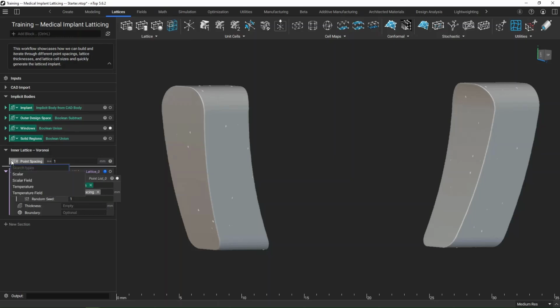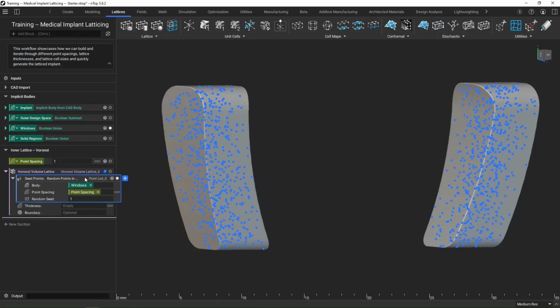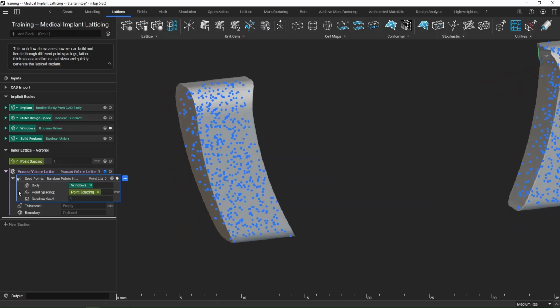I'm actually going to click on this number right here and turn this into a scalar field. Maybe you haven't really gotten into scalar fields just yet, but really I'm doing that so that I know that I can, in the future, variably change this point spacing. So right now we've got the constant 1 millimeter point spacing, but because I see this field icon here, I know that maybe I could use a ramp in the future and drive it. So we've got some sort of variable change there. We'll keep it nice and simple for now with just that 1 millimeter. But by creating that type, then we have the flexibility in the future to use it.